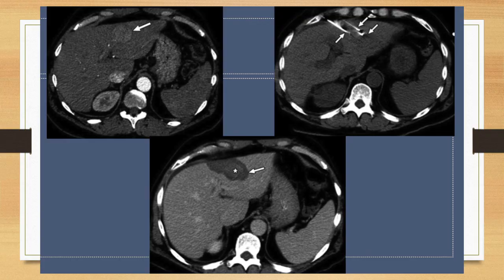This is a picture from the radiofrequency. So just like the lung, same thing. You guys are going to be experts at reading these now. So aorta, it's a contrast study. You can see the mass there is enhancing. Here's with the probes going through the skin. Here are the ribs, going through the ribs, here treating it. This is afterwards, and this is again what we want to see. It does look larger, but this is all dead tumor in the tissue right around it.